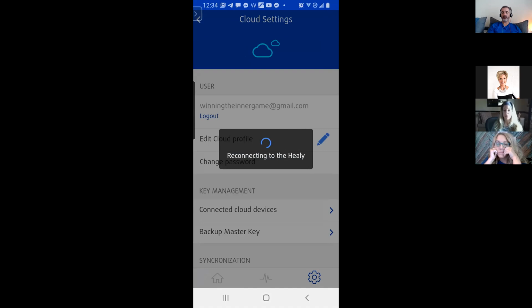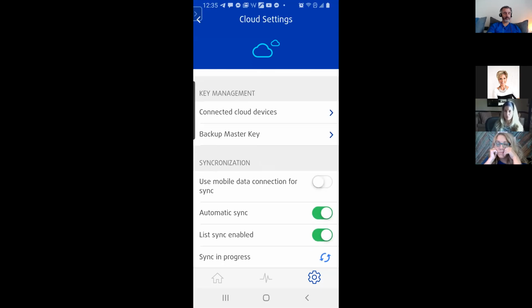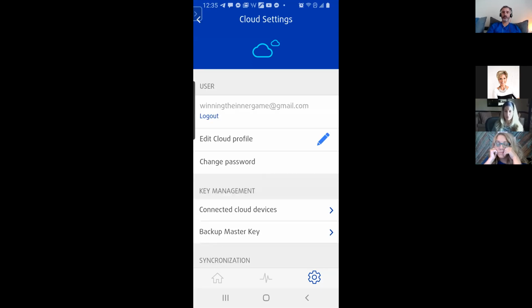Now, if in the future I was trying to find my master key, maybe I lost my device, maybe I had to reset the whole thing, something happened. I'm like, oh, I need my master key again so I can log back into my Healy and get access to all my client information, right? What I can do is go on here and search in my email.